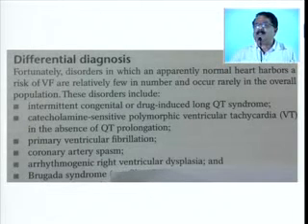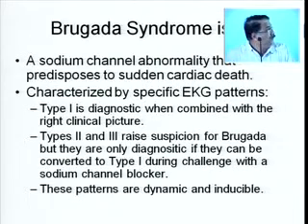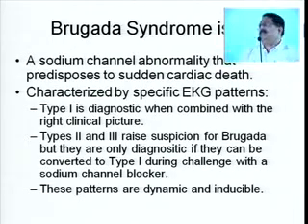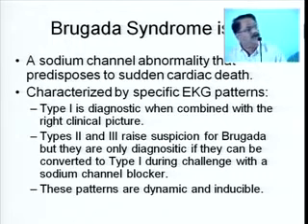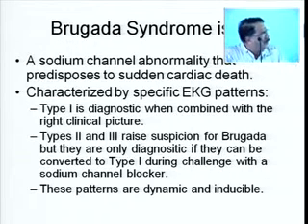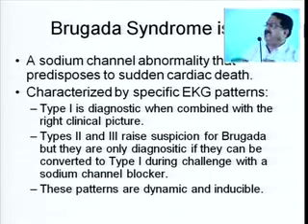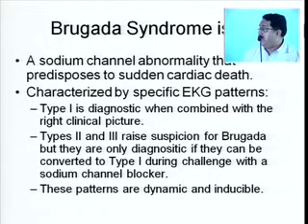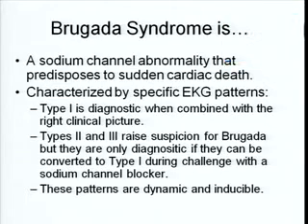The ECG is classic of Brugada. Now what is this condition? I am not going to highlight too much the molecular or genetic reason for this Brugada. The problem is, it is for you to identify who has Brugada syndrome, because it runs in families.